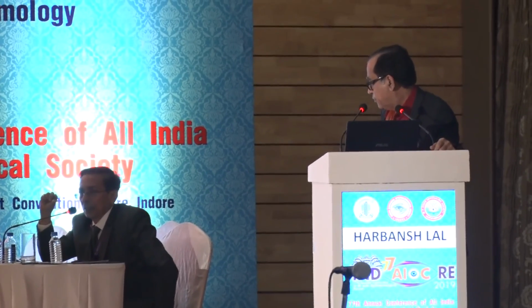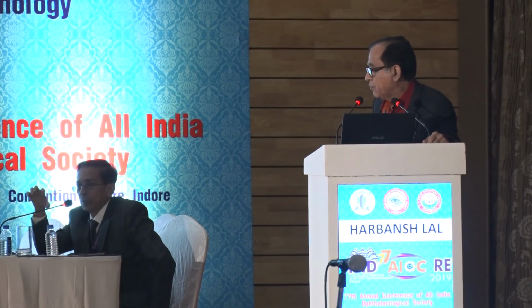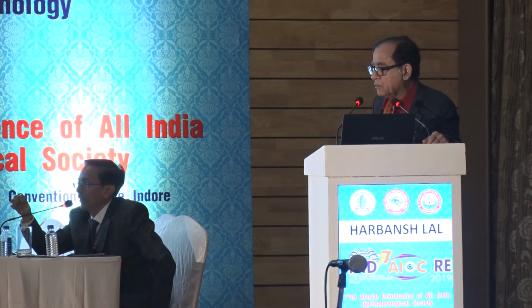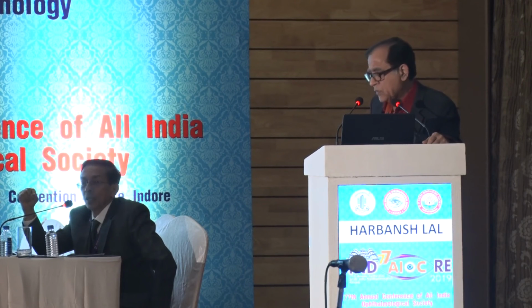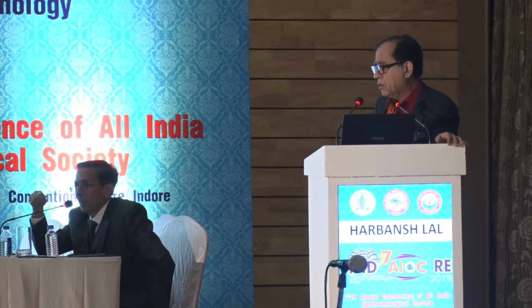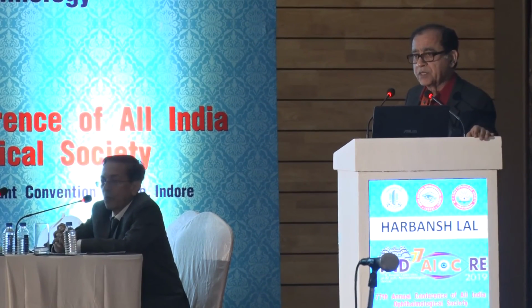It is slightly bulky, and because of the heat radiation, sometimes in subluxated cataracts where the zonules are weak, because it works by fibrosing, by burning, there is a shrinkage of the capsule. So it gives slightly more stress on the zonules, and if you move and if it is not stable, there may be slight dislodgement of the nucleus, especially in subluxated cases. No, it is not the shrinkage of the capsule which causes pressure, but of course the suction which you produce over there may cause pressure on the zonules in a subluxated cataract.